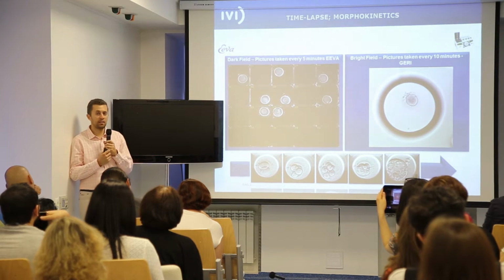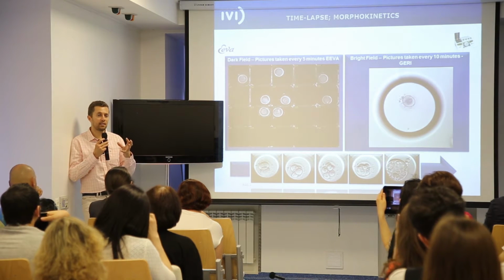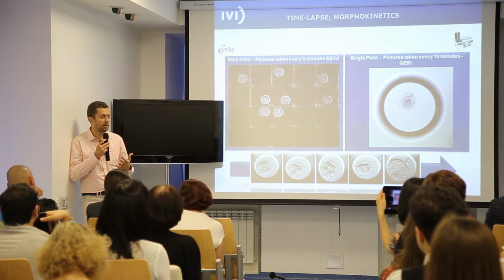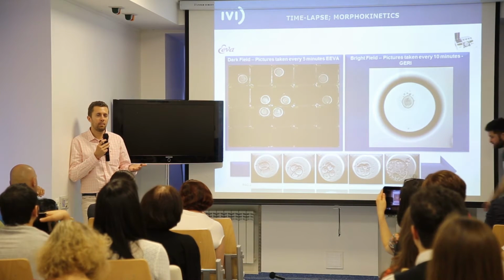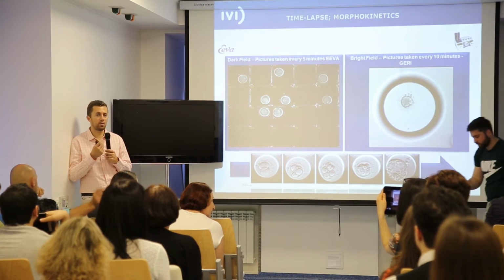But the possibility of the dark field is that you can combine this video with software that is able to track the embryo automatically and analyze it. So behind the dark field, there are a lot of opportunities for software analysis that we will see later.